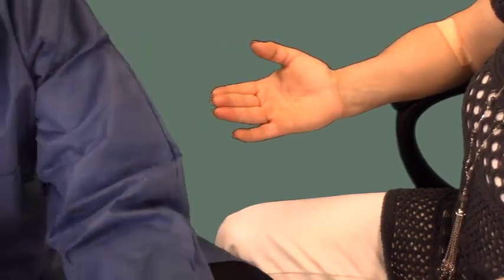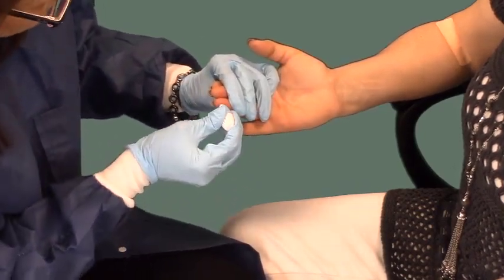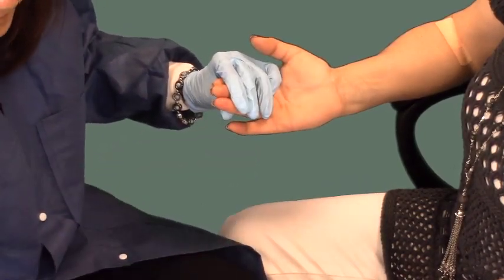Cleanse the finger with alcohol using back and forth motion. Place the lancet such that it crosses the fingerprint lines to get a better droplet of blood.